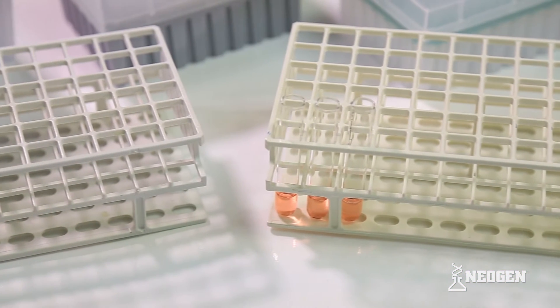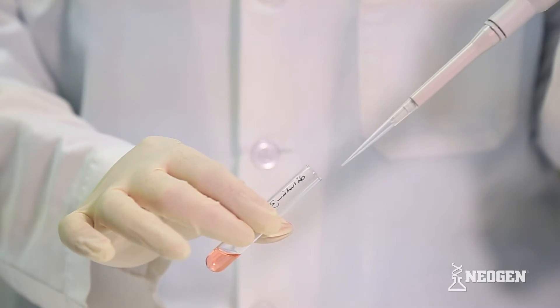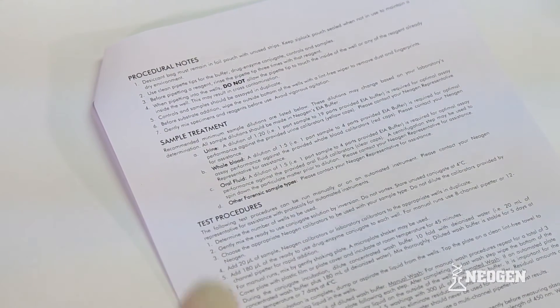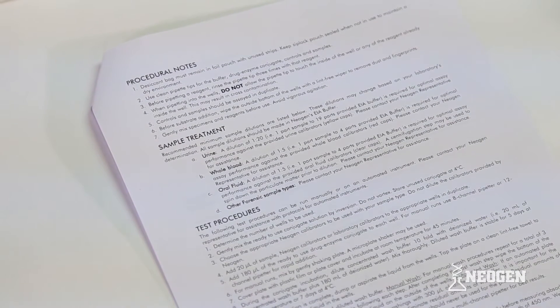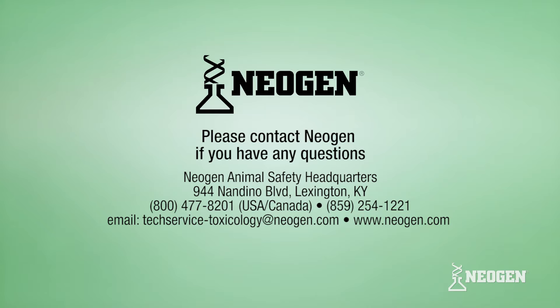Sample Treatment. Some sample types require a dilution to mitigate any matrix effects. These dilutions must be prepared prior to running. Locate the sample treatment section of the product insert to determine which sample dilution is appropriate for your sample type. If your sample type is not listed, contact technical support for more information.